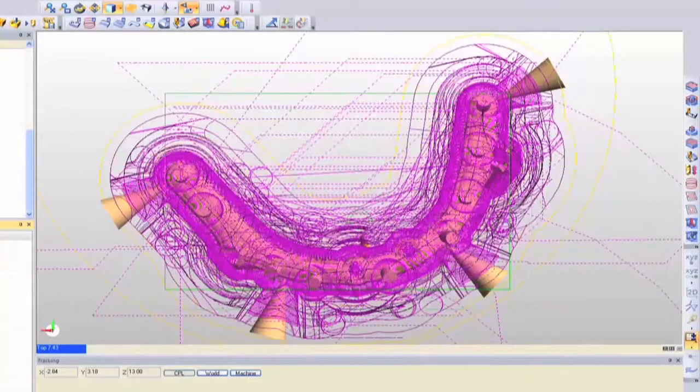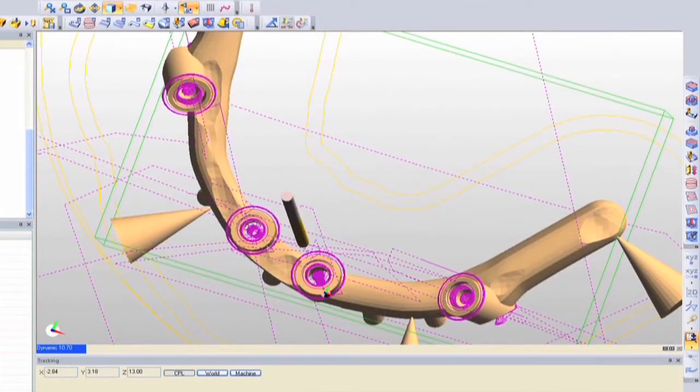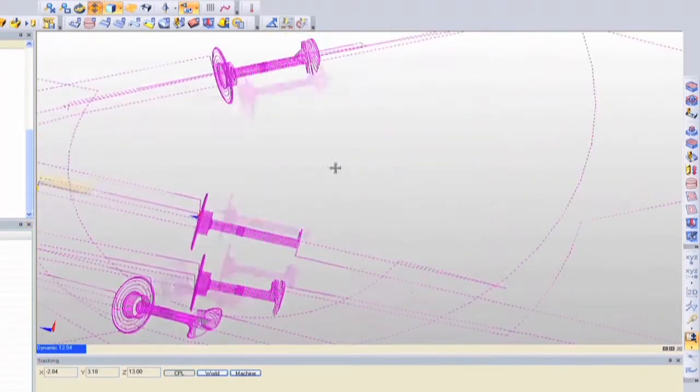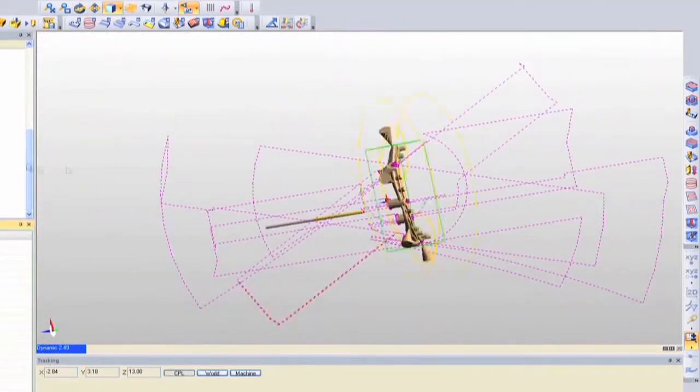The approved design file is then converted to a file type that can be executed by the milling software. That software runs a preliminary routine that nests the virtual bar within a digital blank and maps out the proper tool path.